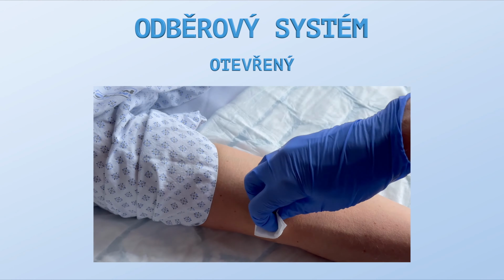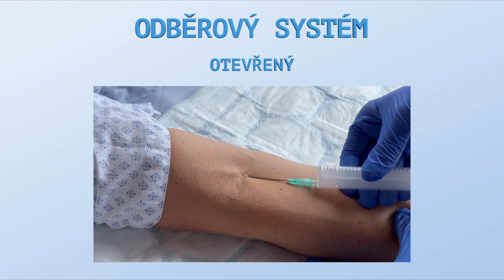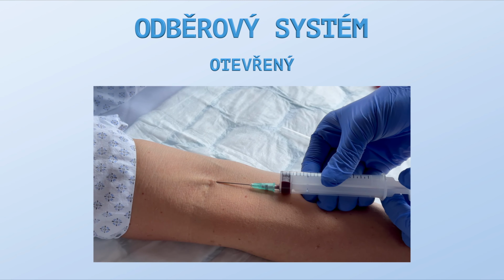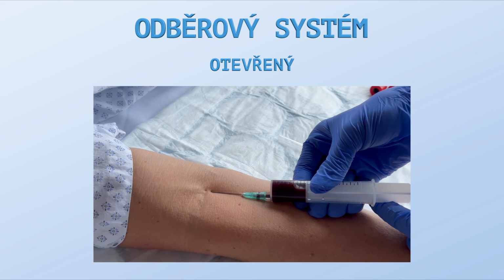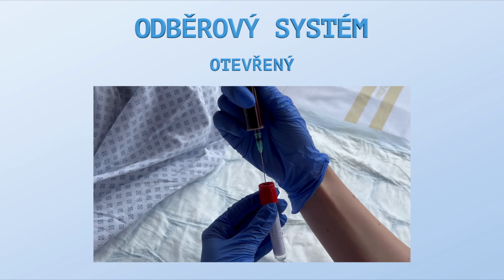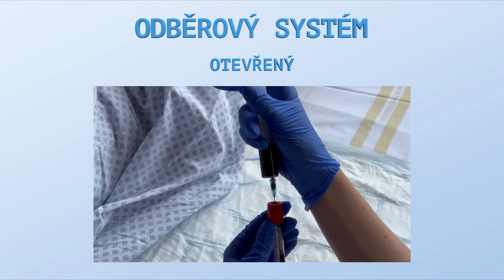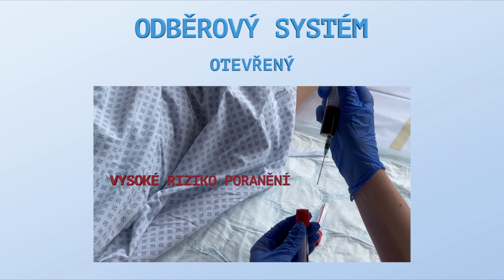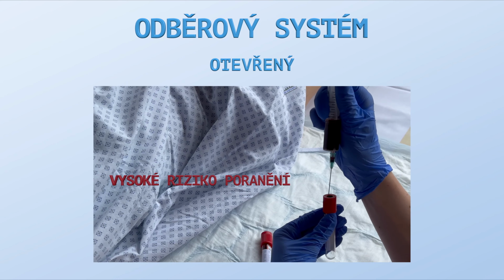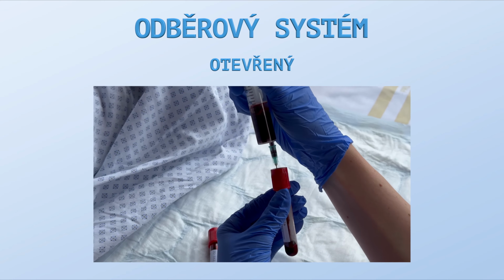Open blood collection system. When collecting blood, a syringe with a needle is sometimes used, usually with a larger diameter to prevent damage to red blood cells. However, this type of collection increases the risk of injury to the healthcare worker from the sharp object and contamination with biological material. It can also affect the pre-analytical phase of the examination when filling blood into test tubes. For these reasons, the open system has been replaced by a closed system. In current practice, open blood collection is used exceptionally in cases where the use of a closed system is problematic.